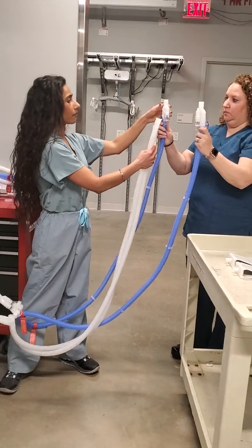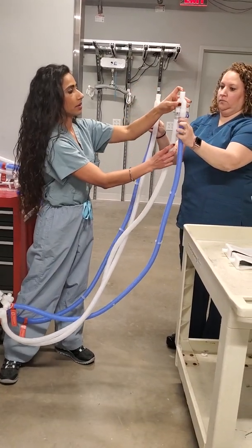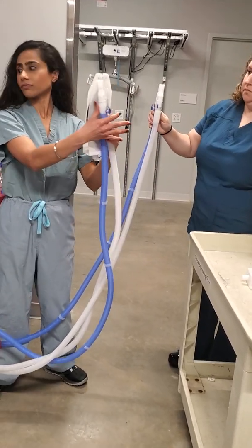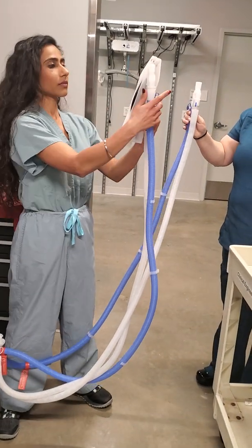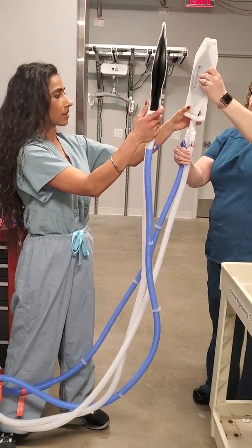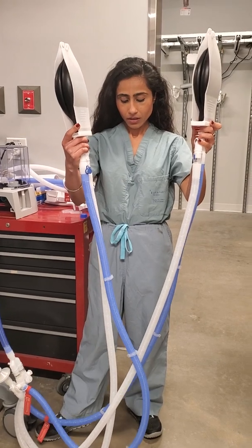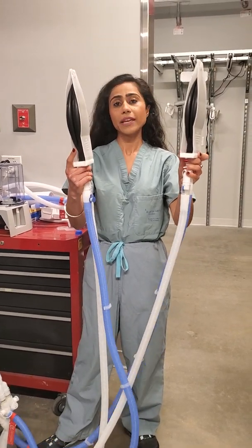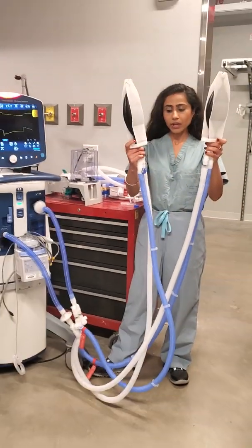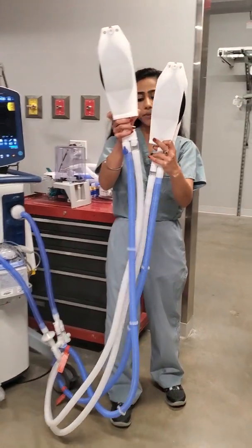Each of these Y pieces will then go to the Y tube, and each Y tube will then be connected to the ET tube and patient lungs. Now here we are with two patients being ventilated through one single ventilator. You can see the one-way valve for the expiratory limb is right here.